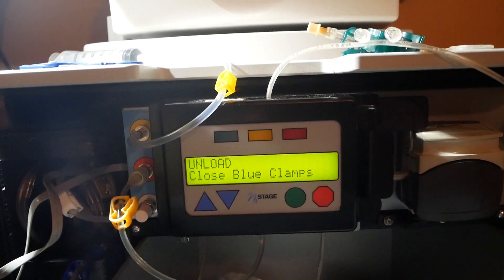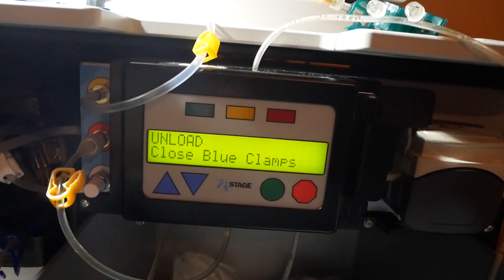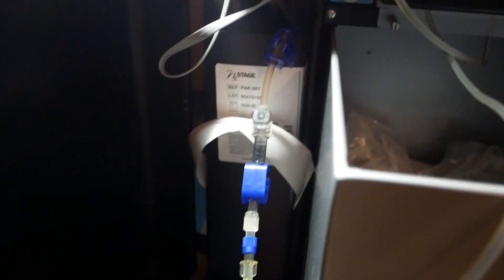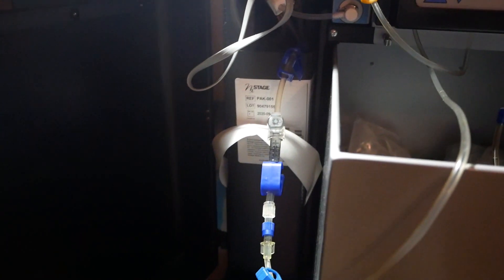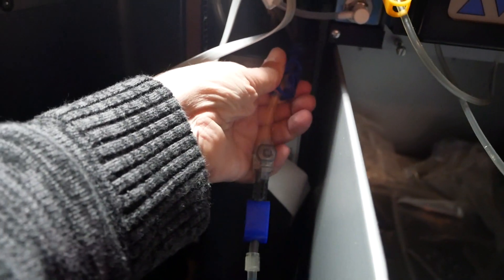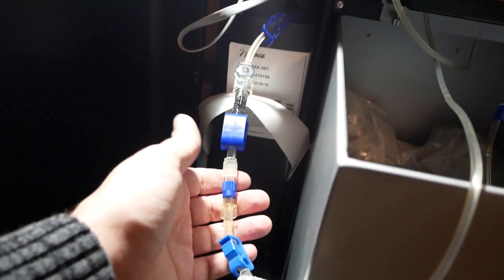Now it's done flushing - it beeps when done and changes the message on the screen. It says 'unload, close blue clamps,' talking about the blue clamps right here on the side of the machine. There are three of them - I'm going to reach up and clamp the top one, clamp the middle one, and clamp the lower one.